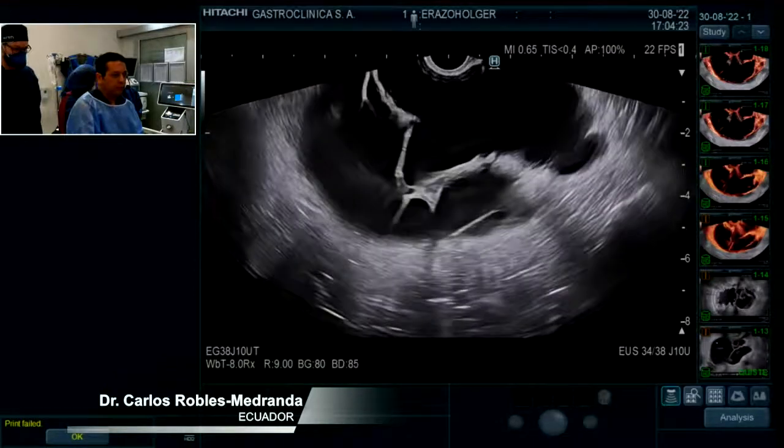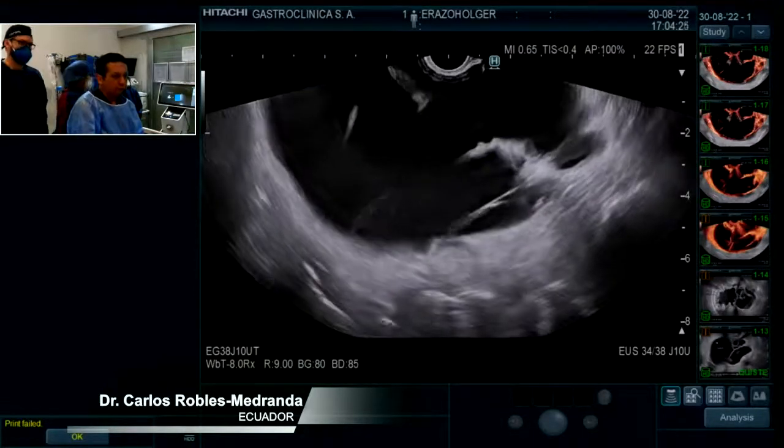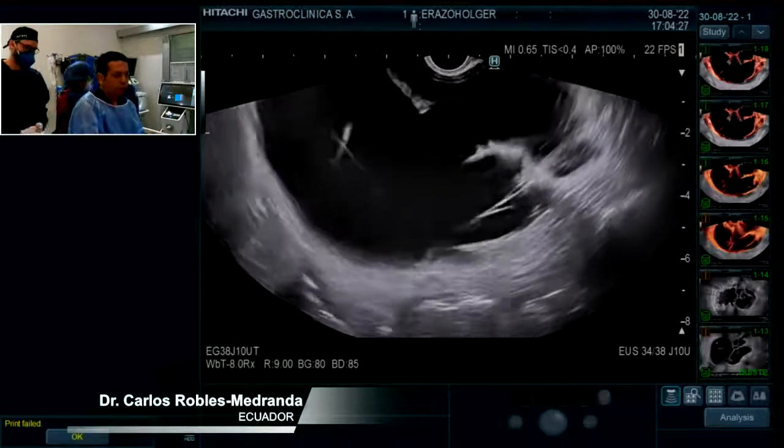So today I would like to show you this case. This is a very interesting case.